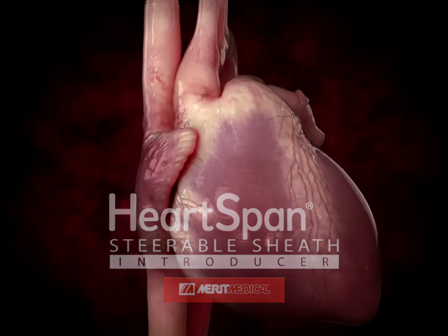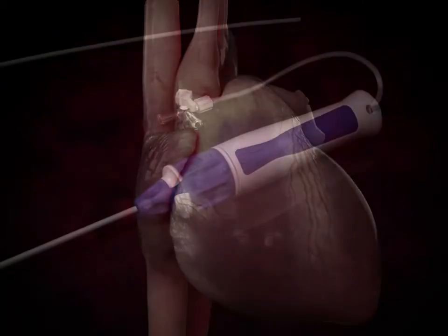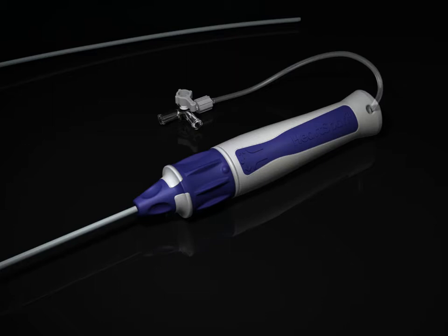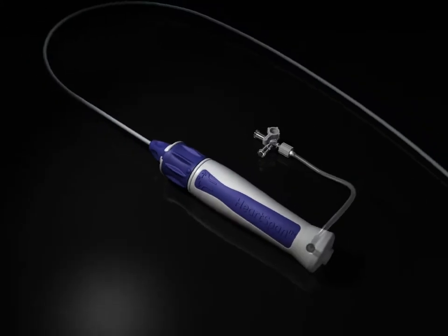Introducing the HeartSpan Steerable Sheath Introducer from Merit Medical. Extend your coverage, control, and comfort. Extend your options for navigating cardiac anatomy.